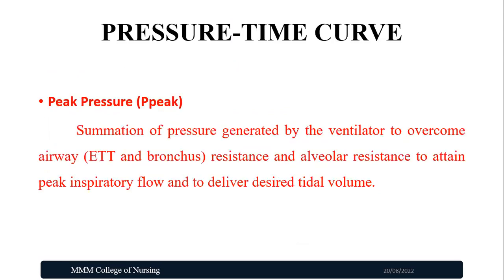Before going into the ventilator alarms, let us understand the pressure time curve. While you may notice several waveforms on the ventilator, each with their own nuances, a fundamental understanding of the pressure time curve is important for the emergency care or critical care nurse. Pressure is created when there is flow directed into a closed system, such as the lungs. Resistance is created in the system from the endotracheal tube, the airway, the chest wall, and the lung itself.